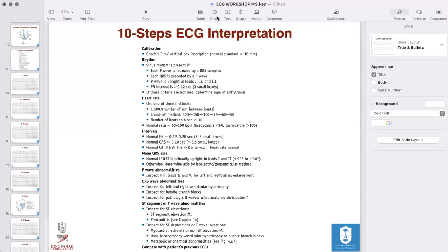Okay, there's a question about the 16 lead ECG and when we need to order it. Very excellent question. So what he's talking about, Abdurrahman, is posterior leads and right-sided leads, where we do extra leads on the back and also on the right side. That's where we suspect that we're missing an acute myocardial injury, like an ST elevation MI, on the right side and the posterior leads.